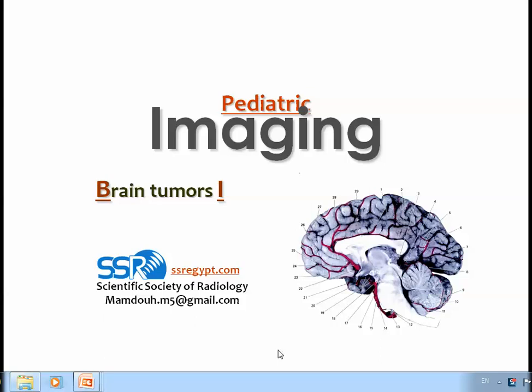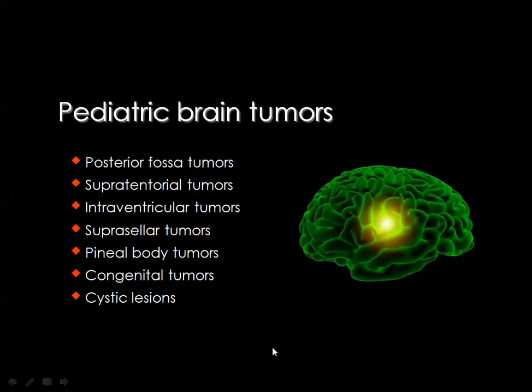This is actually a very long subject, and I will handle it in two separate lectures. The first one will deal with some of the posterior fossa and supratentorial tumors, and after that we will continue with the other imaging with the other tumors. And these are the issues we would like to expose.